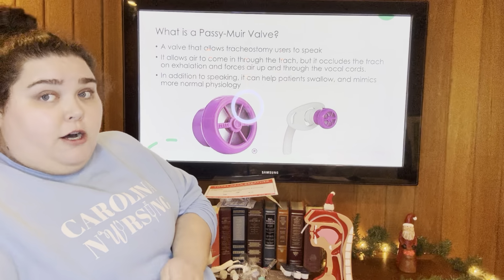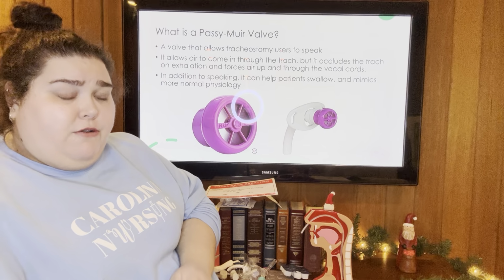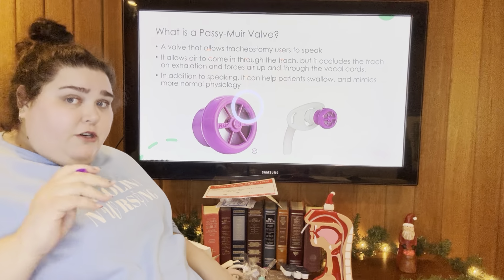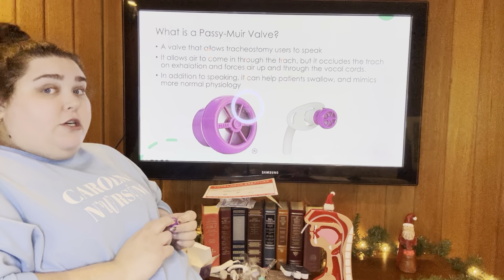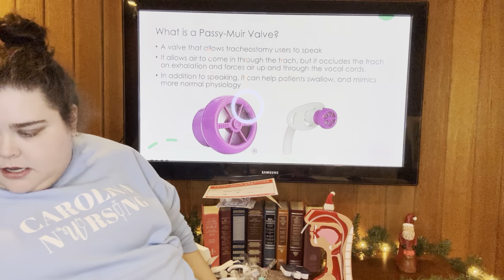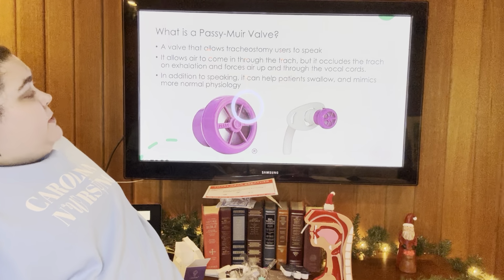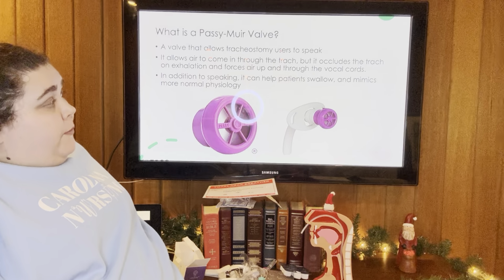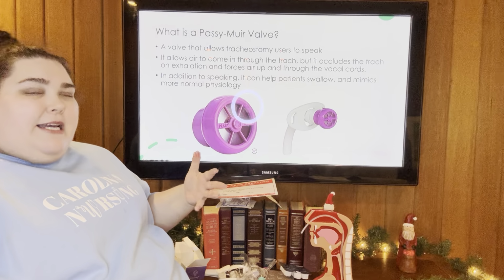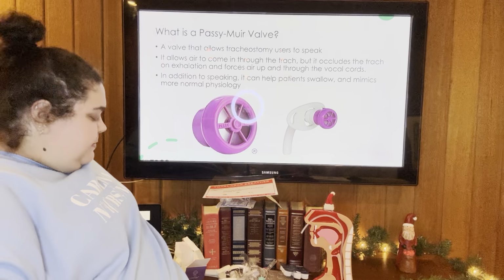These can get coughed off. If you have a patient with a really forceful cough, it's not unusual for it to go flying, and then you have to find them because they're also very expensive. They cost about $150 to $200 a valve. So we want to make sure that we don't lose these for our patients. They have a little carrying case that you keep with them that makes it easier to find them. It also can help patients swallow. If you're trying to eat with the trach and relearn how to swallow, because it's mimicking that more normal physiology, you're more able to do that without having the risk of aspiration quite as bad.